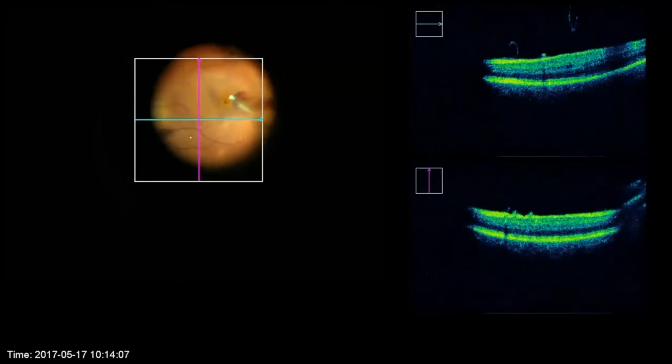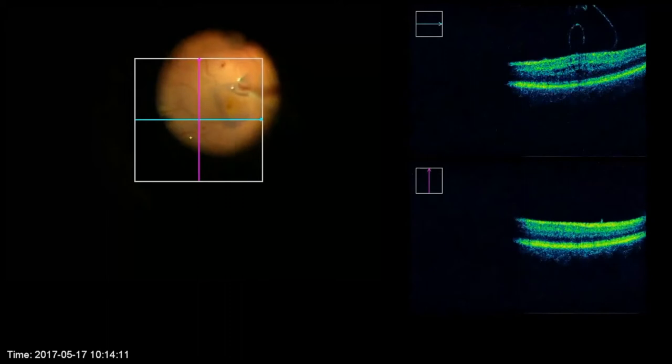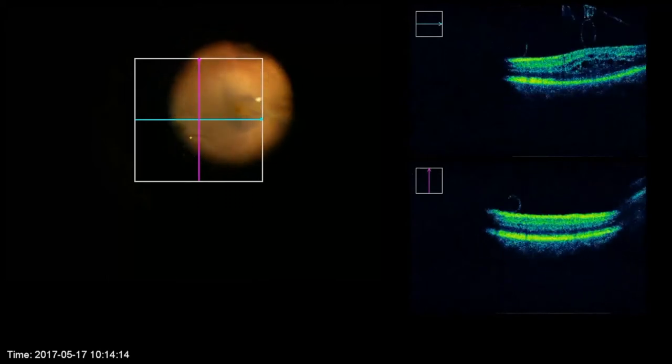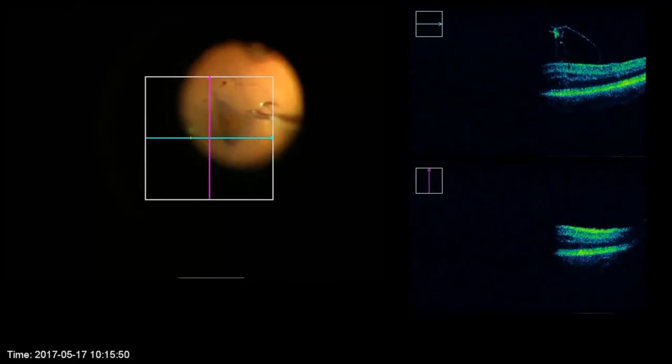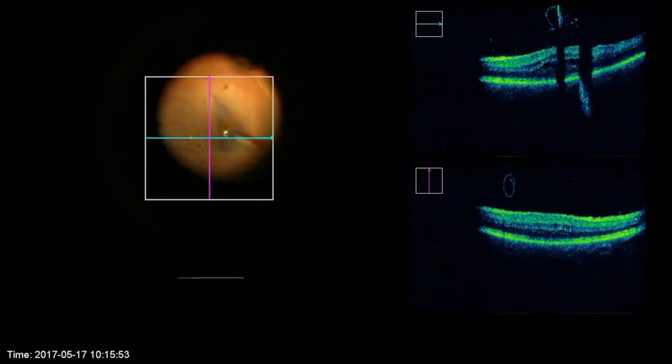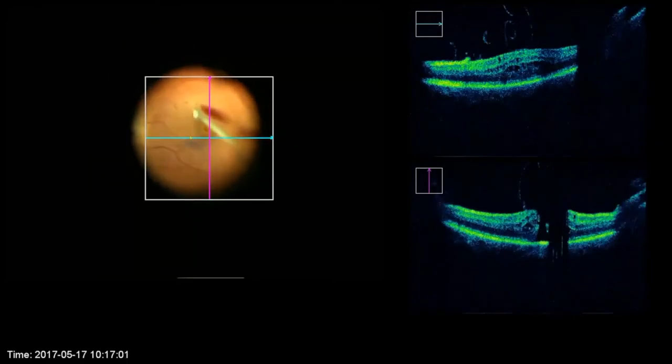This is another picture. You see this is the intraoperative OCT. This patient had a macular hole, and you see after staining the membrane with Membrane Blue Dual, I do the ILM peeling and I just leave it connected to the edges of the hole, and then I use the vitrector and cut the flap so that it's not too large, and then you can use the vitrector or any other device to put it inside the hole. You can see it here, and the OCT is very nice because you see how your flap is placed and whether you have to change anything.